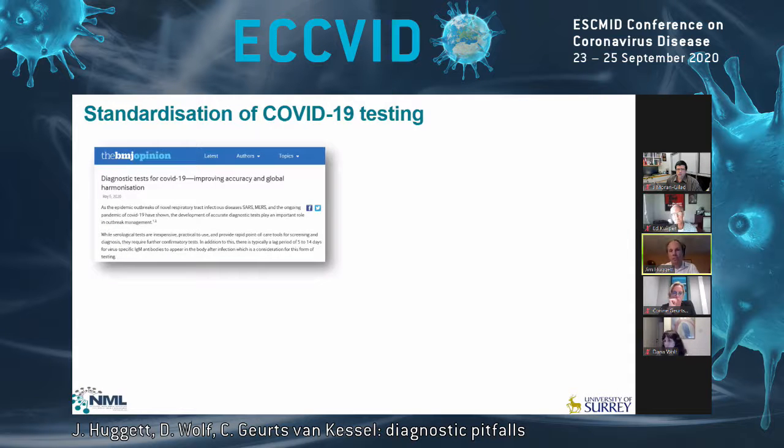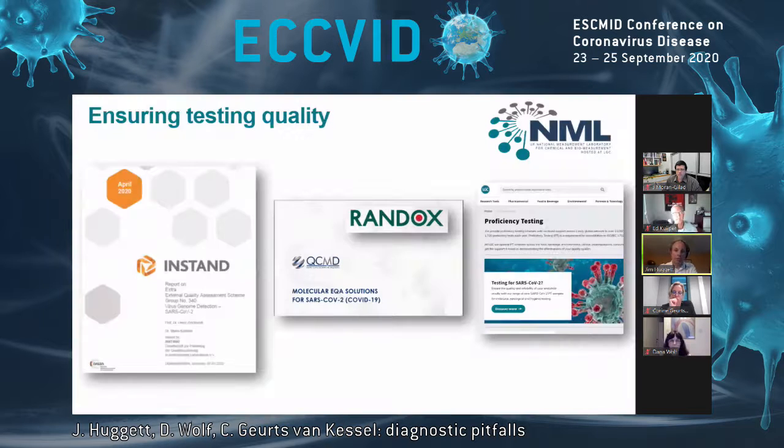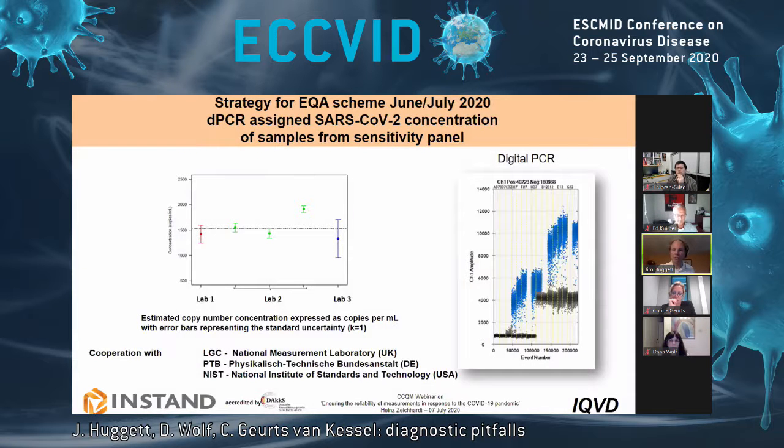There is work in the standardization community going on, though, throughout the globe, really, working to try and improve standardization of molecular measurement before SARS-CoV-2 testing, but now a lot of us are working on SARS-CoV-2 testing. There are external quality assurance methods. This is just 3. I'm sure many of you are familiar with them, which will improve the harmonization of those measurements. And we're also working on methods like digital PCR with very clearly defined standard operating procedures to try and provide reference measurement procedures that may support the value assignment of reference materials, quality control materials, but also clinical samples. So we can look at those reference ranges that may, in the short term, certainly support the use of molecular methods like real-time qPCR and the isothermal method, and perhaps in the longer term, actually work as diagnostic methods in their own right, because they are much more reproducible.